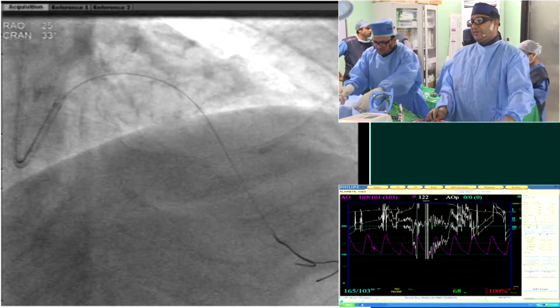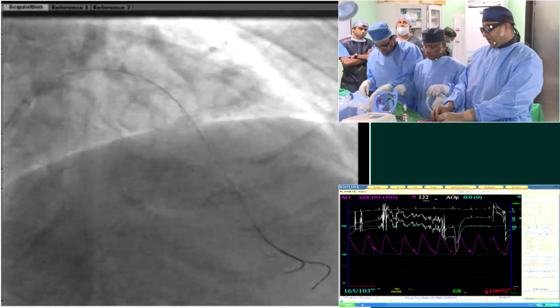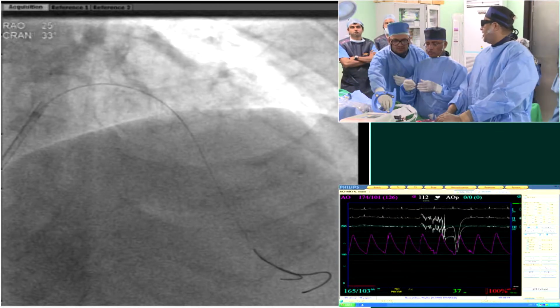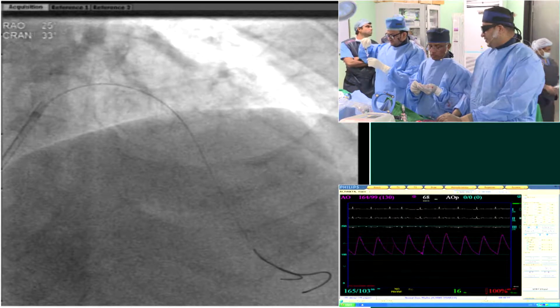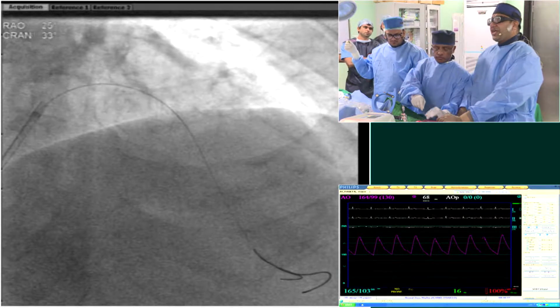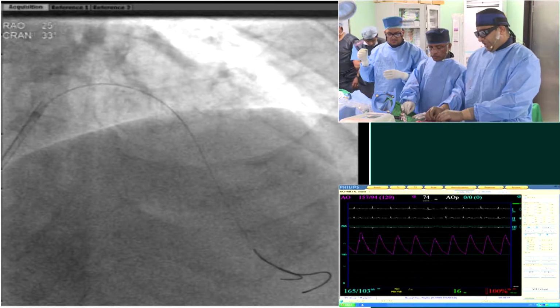Have you thought about delaying the OCT until after stent implantation? Yeah, I think now I'm going to do just that. Probably open the vessel, stent it, and then do an OCT to see how it looks. Because I'm not going to try any more OCT after the Flextome. But with the OCT not tracking, I think the stent tracking may be difficult too, so we might need a GuideLiner or something.